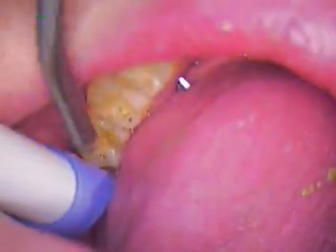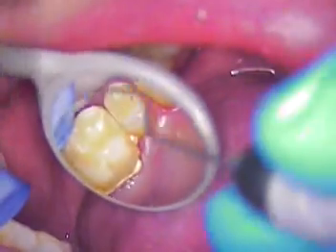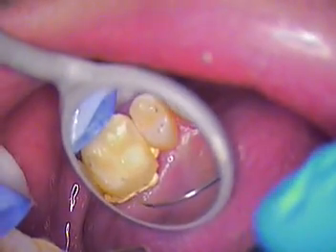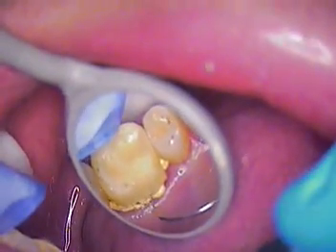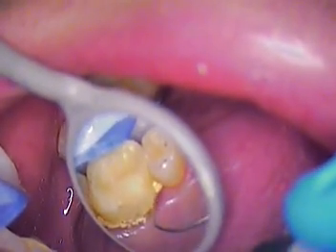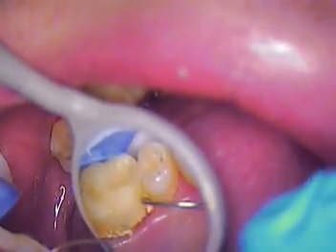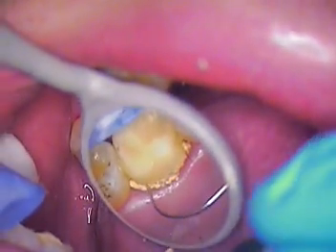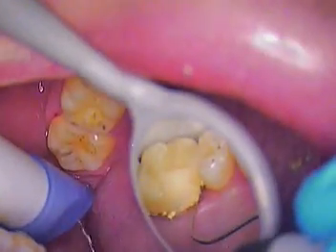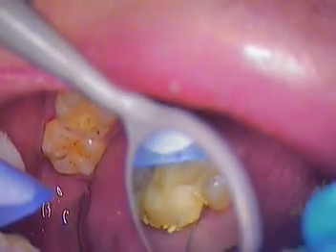Now, the key is cleaning up the cement. Now, we left that cord in there purposely. We're going to start now lingually. As you're cleaning your cement, you're going to check the margins, right? Make sure everything was seated properly. That's important. And it's a nice white color cement, so you can see if you got it all. Now, some of these cements are clear, and boy, they're a little troublesome. You also can see if you got a little overhang.